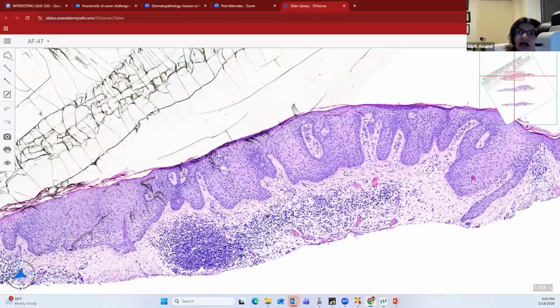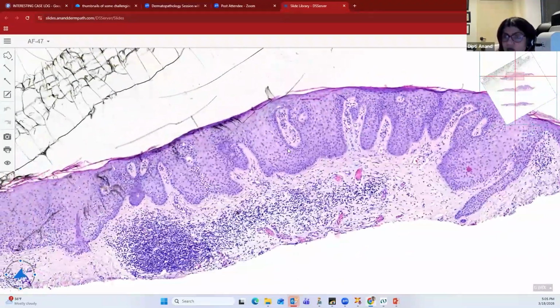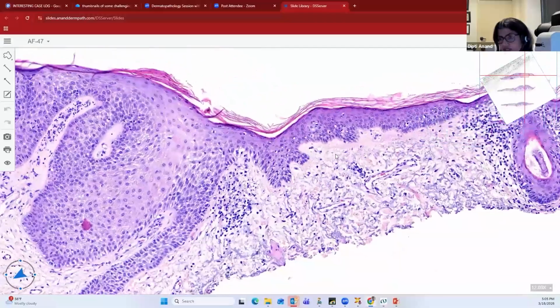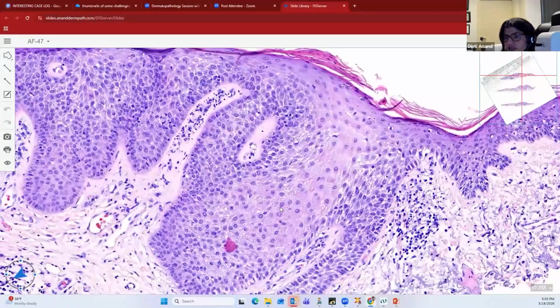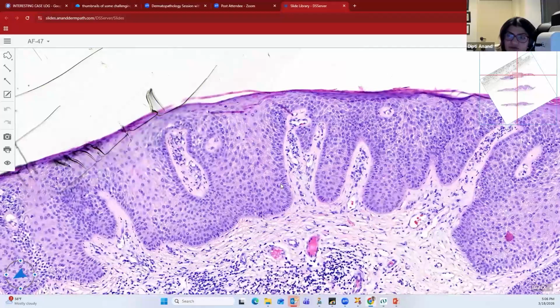I was talking about a trichilemmoma, and the closest differential diagnosis is going to be the pale cell acanthoma. The similarity between a pale cell acanthoma and trichilemmoma is that they both have the clear cells, but the quality of the clear cells is different. In a pale cell acanthoma, the clear cells are the same cells as the epidermal keratinocytes, except that they have become bigger because of the pale eosinophilic cytoplasm, because there is absence of glycogen phosphorylase. So they're the same as the adjacent epidermal keratinocytes, but in a trichilemmoma, the cells are outer root sheath of the hair follicle.